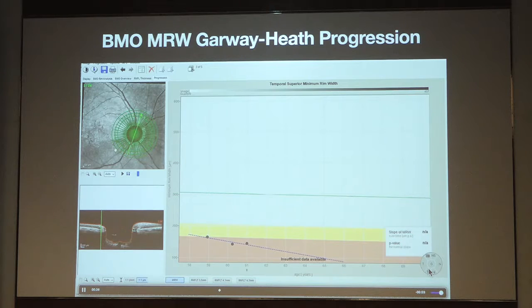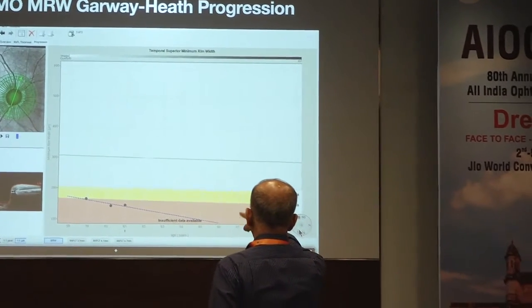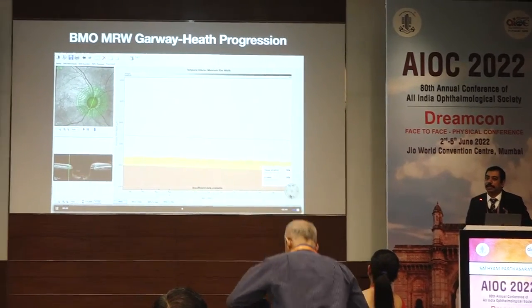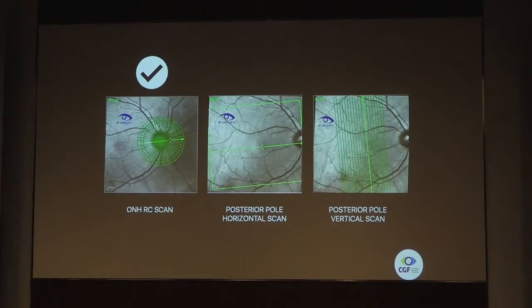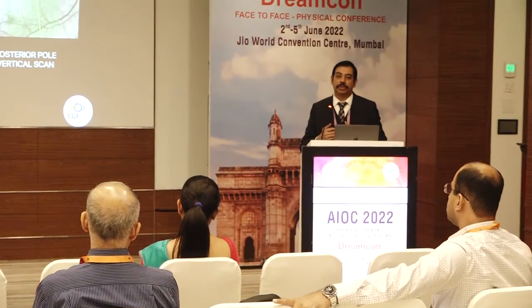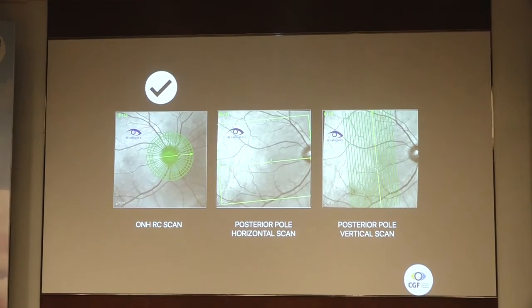See, if it is visual fields, I know it can go up and down. If you have spots coming up and down the regression line, then it indicates that there are outliers. How do you get an outlier? If you have not marked properly, then you will have outliers. As you rightly pointed out, if you see an outlier in imaging, you have to revisit your image. Absolutely. We'll have the discussion time, and at that time we'll see that. That is an important point you have raised. Though these are all automated things, at each visit we have to do the proper BMO marking and the ILM marking, otherwise you are going to have problems.